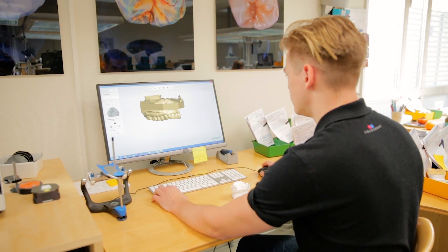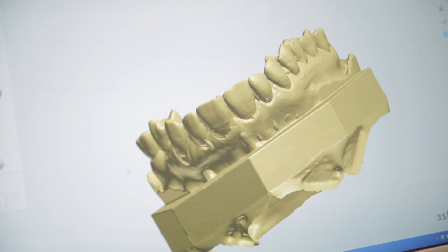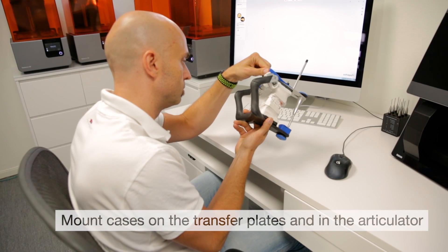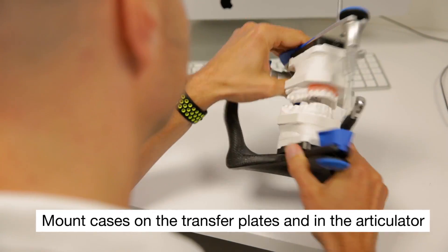We receive aesthetic cases, cosmetic cases, a lot of functional cases, and also quite many implant cases. Basically, more or less all our cases are articulated, and a lot of our clients use the face bow, so we need to mount more or less every case in articulators.